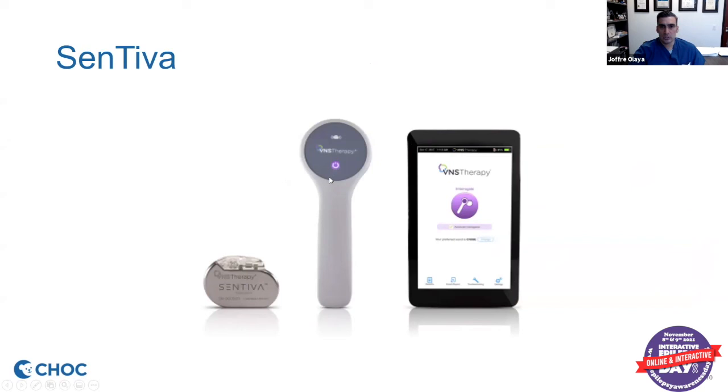When we first implant the device, we turn it on in the operating room. Then typically I will see patients back about a week or two afterwards. As long as everything is going okay, we'll increase the setting a little bit, and then we'll program it so it automatically goes up about once a week over several weeks. It typically takes a few months to get up to the therapeutic level. But just like with medications, we want to make sure that patients aren't having side effects and that they're tolerating it okay.